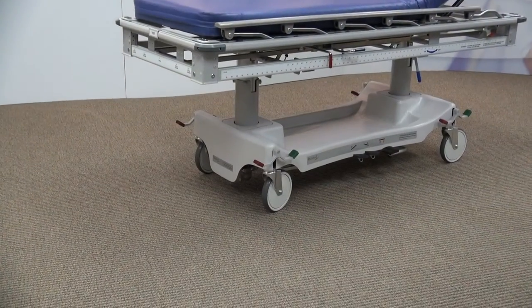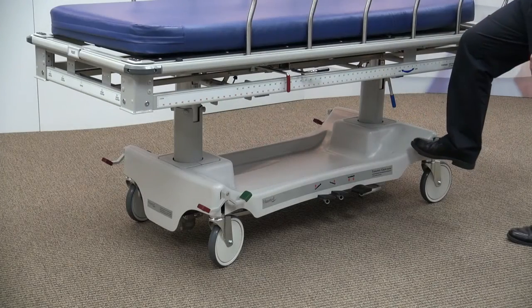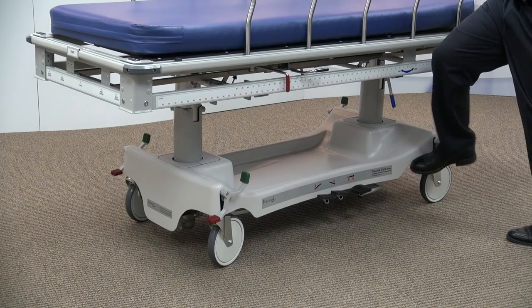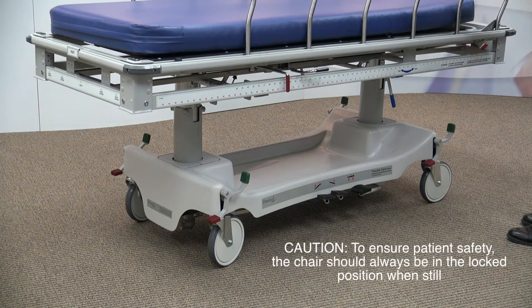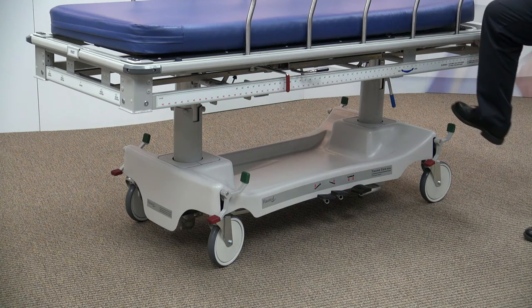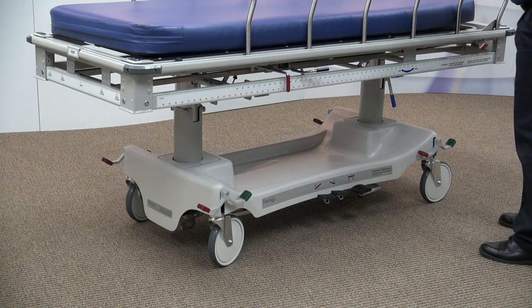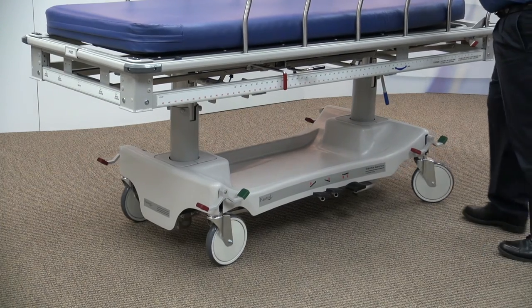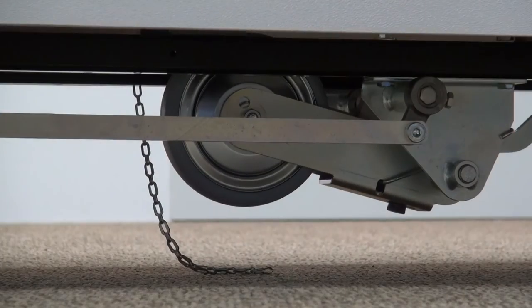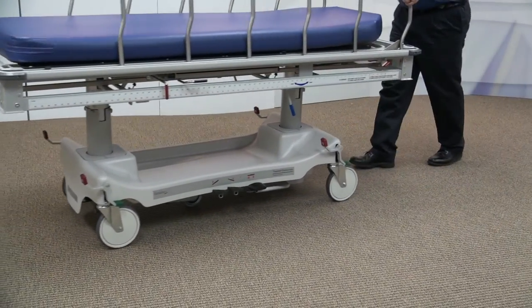The X-Ray Trauma Stretcher is designed with ease of mobility in mind. Pedals are located on all four corners, allowing function from any location. Each pedal can be set to lock, neutral, or steer position. The red pedal in the down position locks all four 8-inch Tente casters. The pedal's position parallel to the floor is neutral, allowing all four casters to pivot. The green pedal in the down position will engage the center straight tracking fifth wheel for steering during transport.